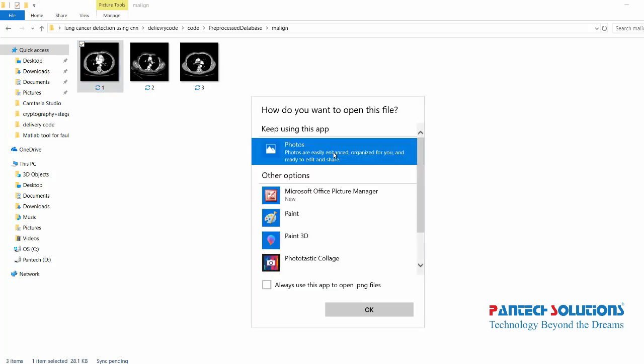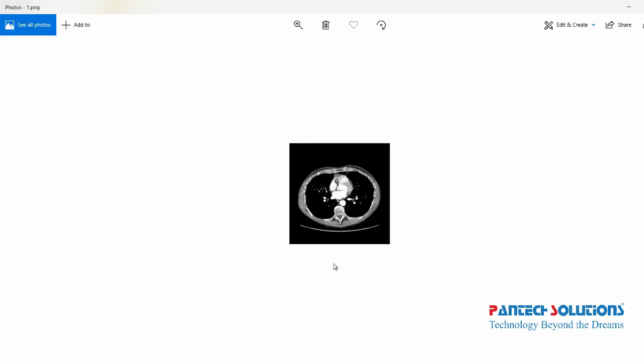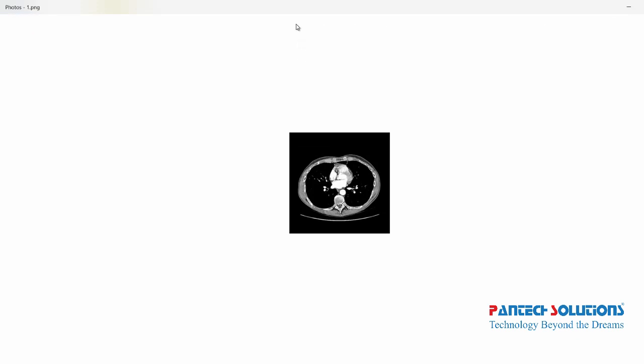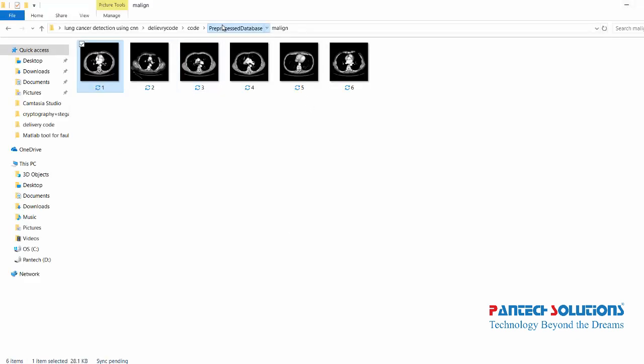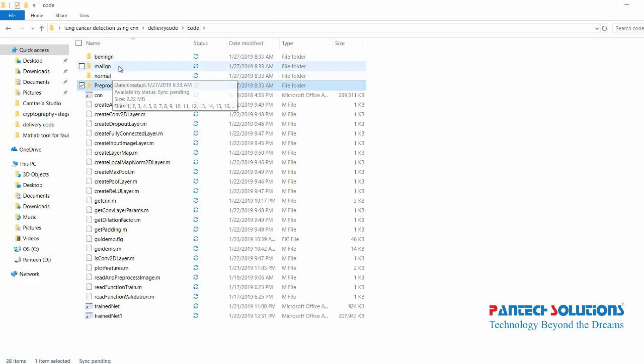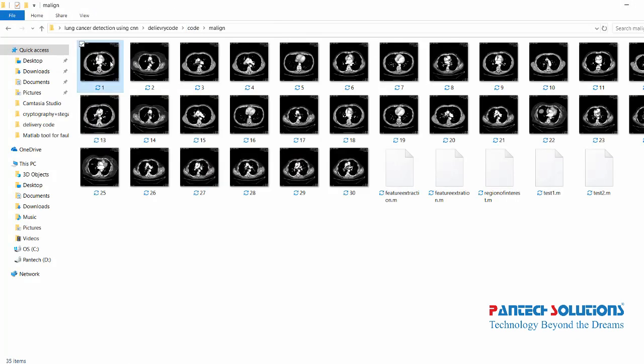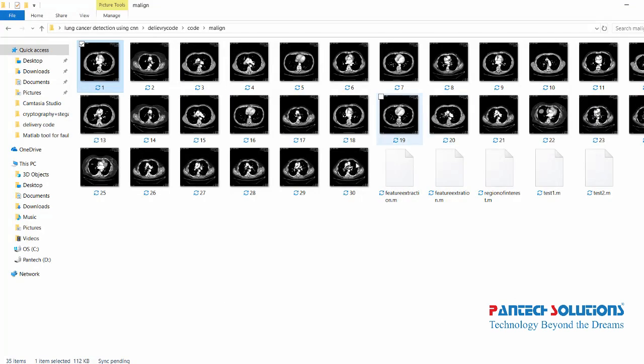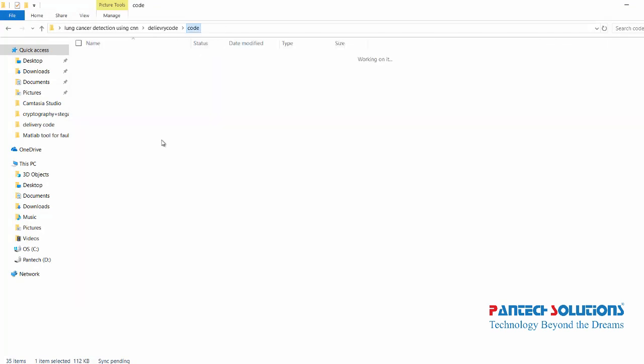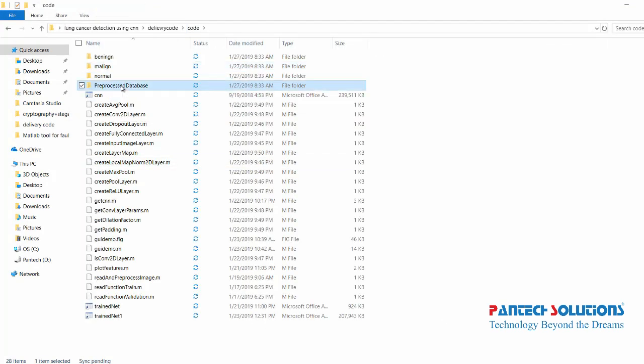Once these images are processed, the next step is training. The training uses CNN.